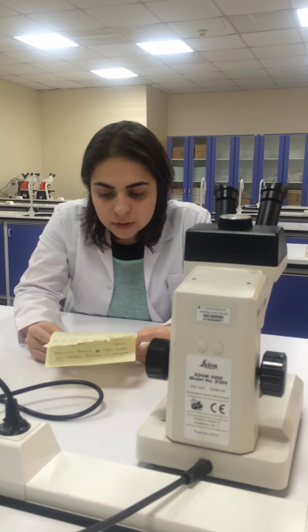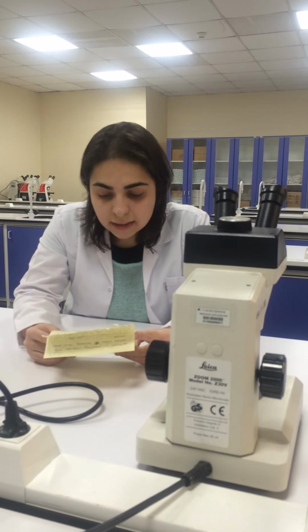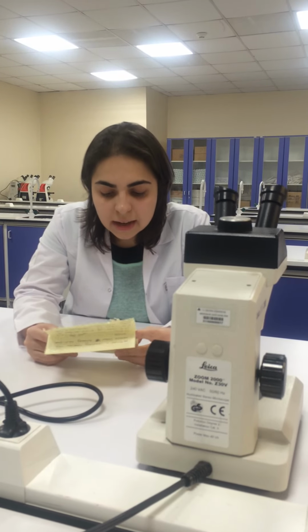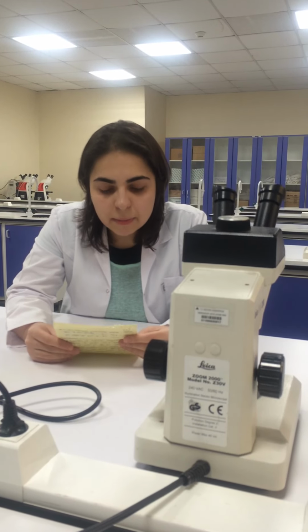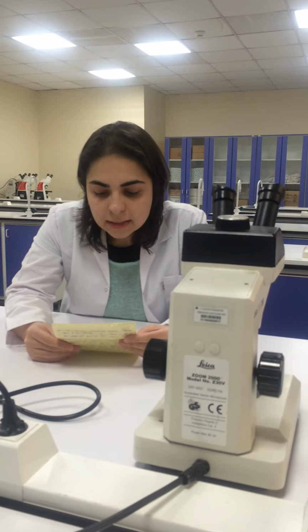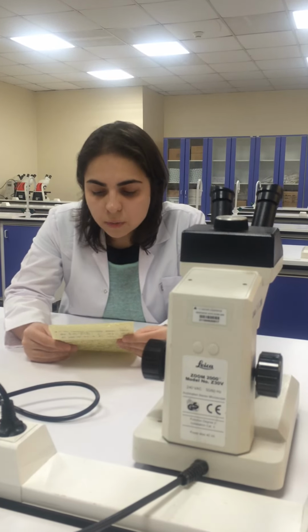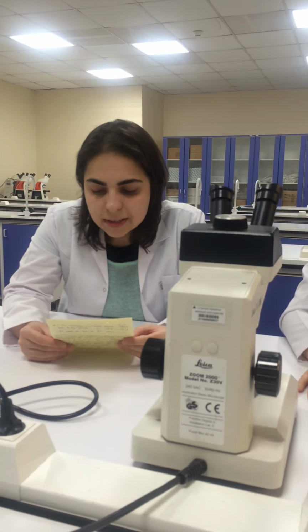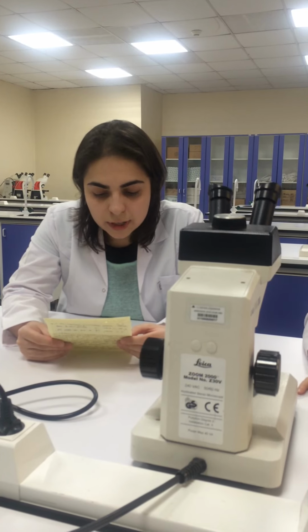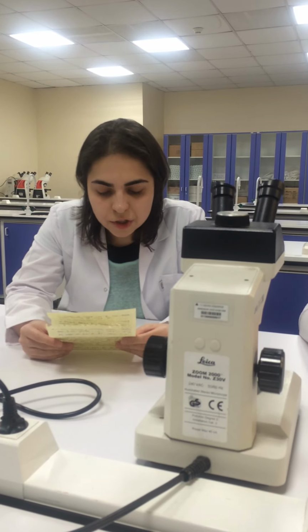Porcine dorsal fat layer of subcutaneous adipose tissue is separated along with the attached skin layer from muscles with the help of forceps. Then sample is immediately immersed into sterilized beaker containing serum-free DMEM. Beaker is placed in a laminar flow cell culture hood after spraying outside of beaker with 70% ethanol. Hood is covered with large sterilized triple layer foil. Then tissue with skin is placed onto foil in facing down position.